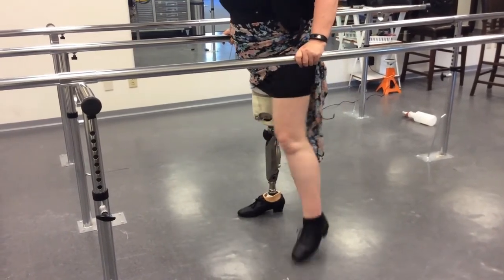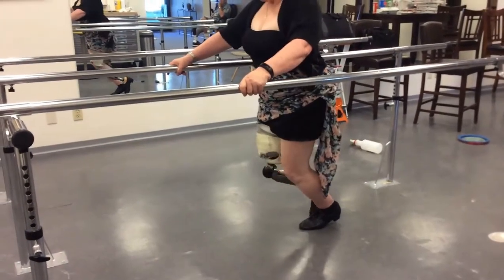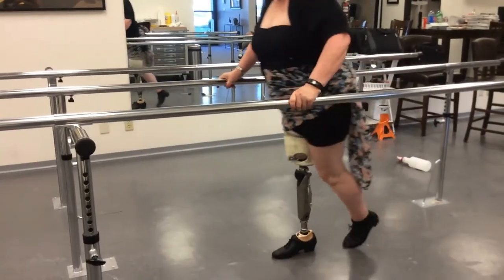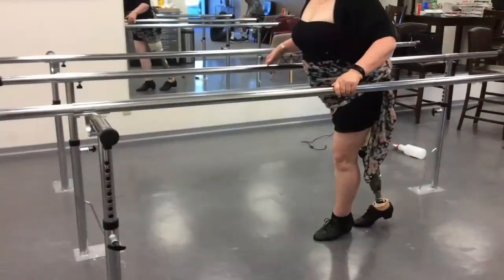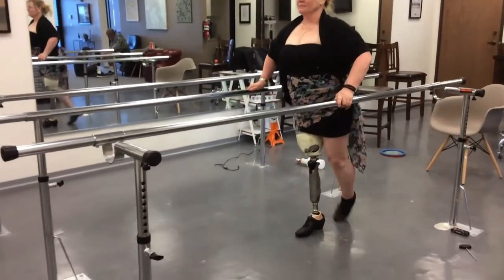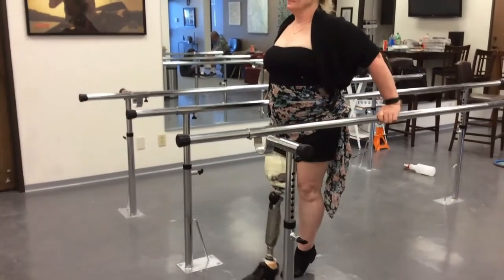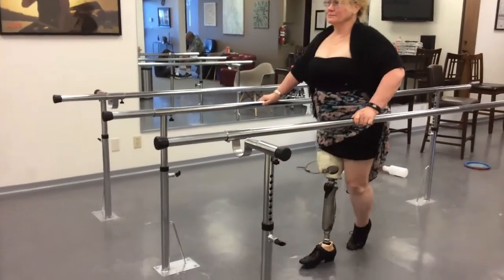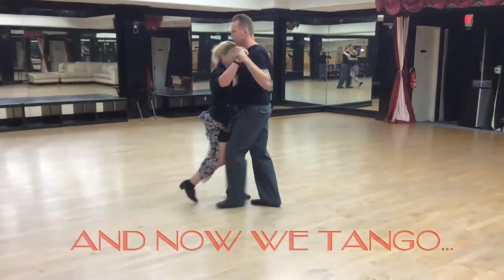Oh, that looks cool. See what I mean? It's finding how far, how to grip, how to push, and make it smooth. There you go. That's better. This is the other bone down. Yeah, and that's still a little bit sensitive, so it must be rubbing a little bit.